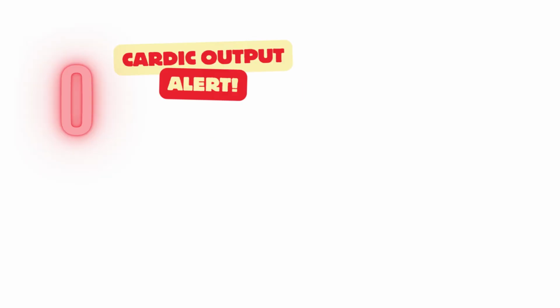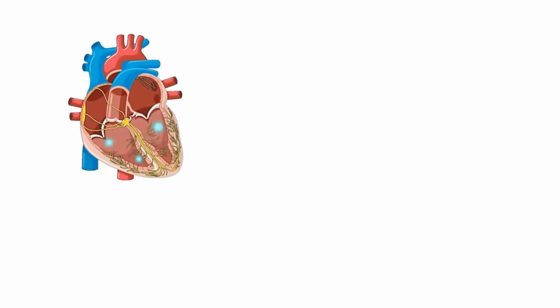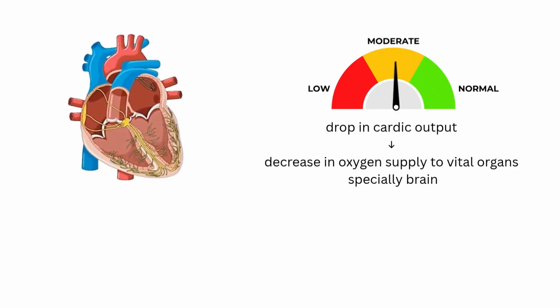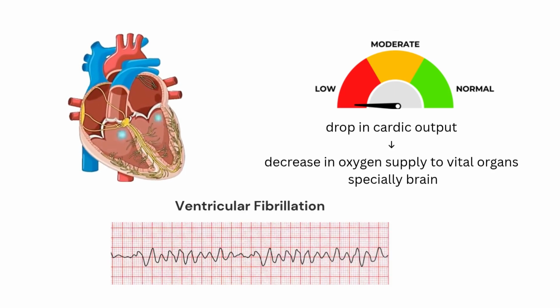Zero. It's a scary number, right? Because zero represents the exact amount of cardiac output a patient has the second their heart goes into ventricular fibrillation. Literally zero fresh blood reaching the brain, zero oxygen hitting the organs. In those crucial ticking seconds, your ability to read that rhythm strip isn't just some academic exercise anymore. It is, quite literally, the difference between life and death.